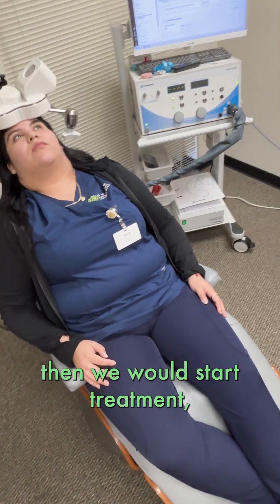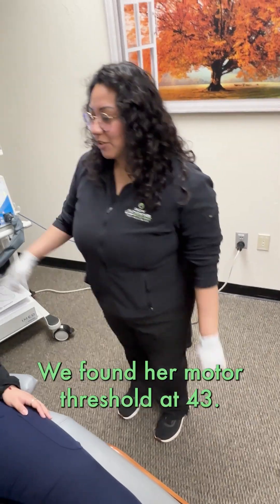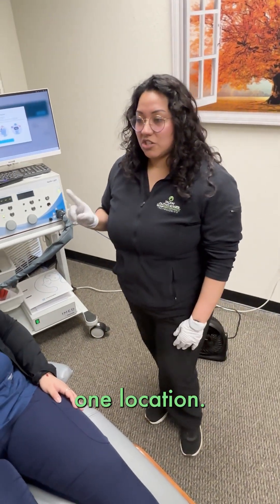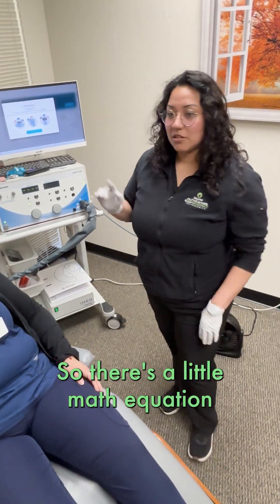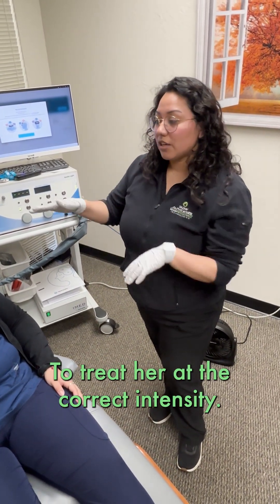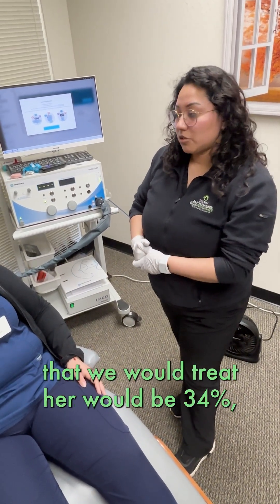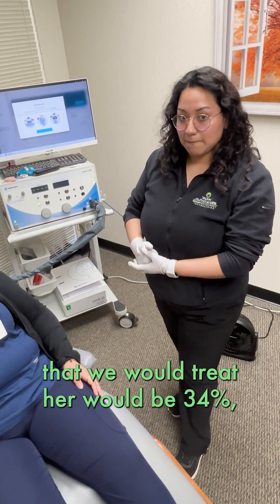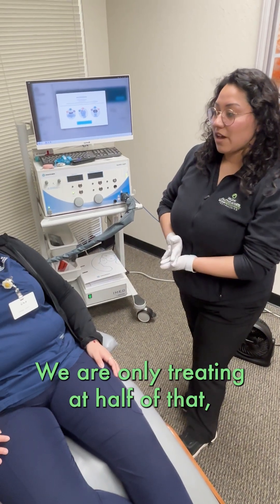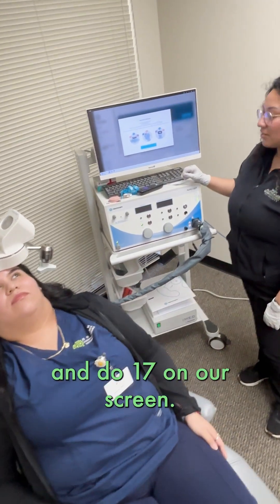So we would start treatment and set it at the intensity we want. We found her motor threshold at 43, and we know we're only stimulating one location. There's a math equation we have in place to treat her at the correct intensity. For her, the maximum intensity we would treat her at would be 34%. Because today is essentially her first day of treatment, we're only treating at half of that — so 17% on our screen.